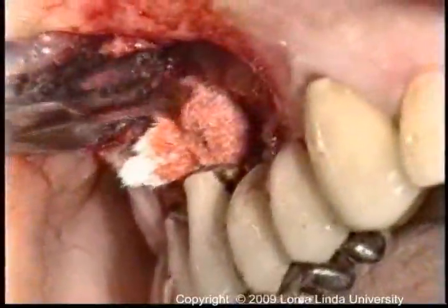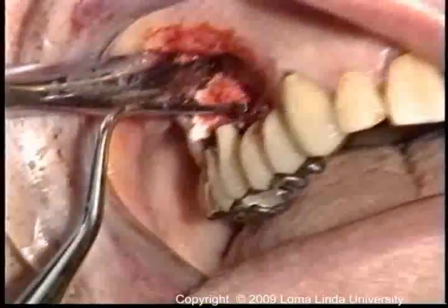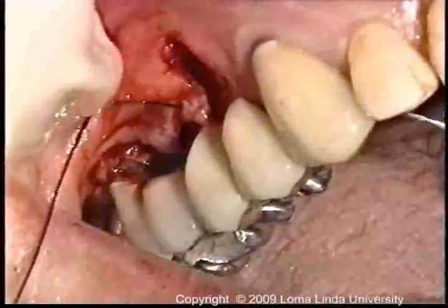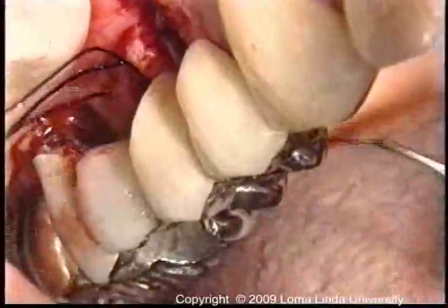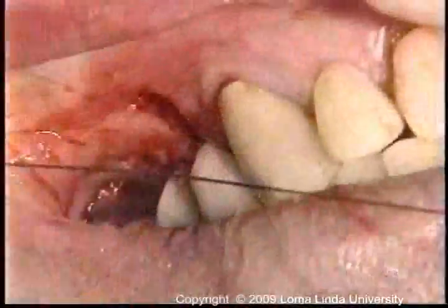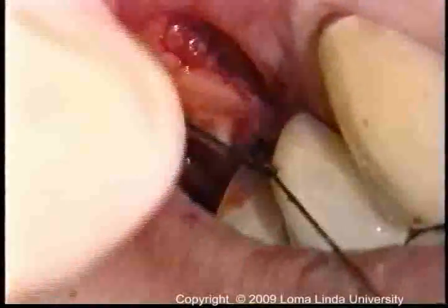The socket is cleansed, curetted, and packed with a gauze to absorb the metal filings generated during the removal of the coronal portion of the root and recontouring of the crown. The tissues are repositioned, and the flap is closed with a sling suture in the horizontal incision in the pontic area. This procedure draws the tissue under the pontic and maintains the proper contour of the tissue in its relationship to the apical portion of the pontic.